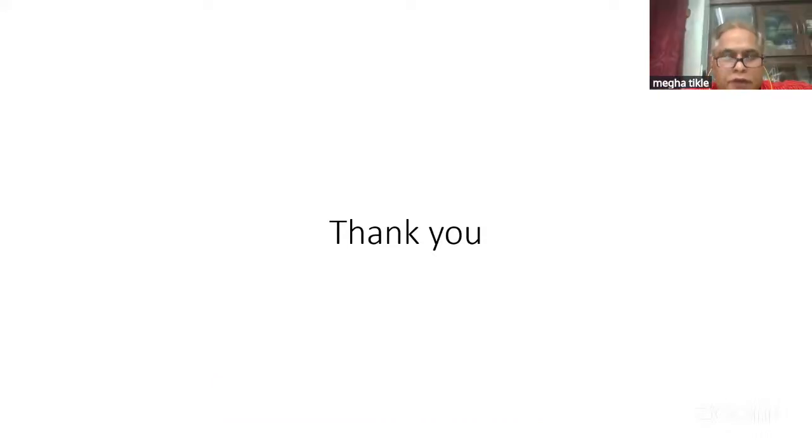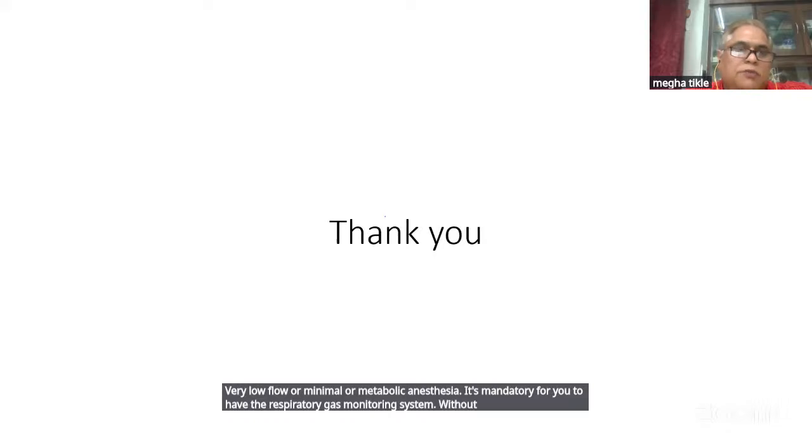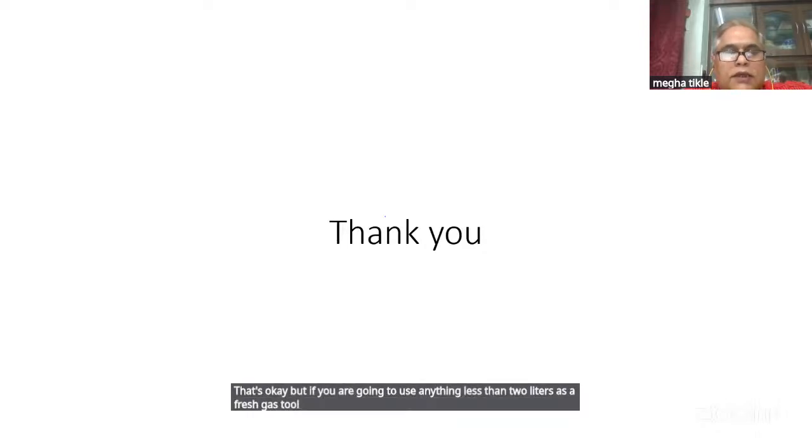If you are using very low flow or minimal or metabolic flow anesthesia, it's mandatory for you to have the respiratory gas monitoring system. Without that, you should not be using low flow anesthesia. So up to 2 liters, yes, it's okay if you use only CO2 to maintain the saturation, which is there. That's okay. But if you are going to use anything less than 2 liters as a fresh gas flow, then the recommendation is to have a complete set of gas monitoring, and then only you can proceed to give low flow or a metabolic flow anesthesia. So that is the mandatory thing.